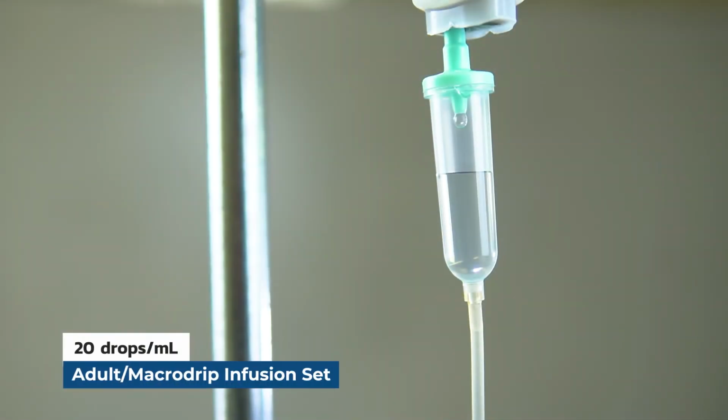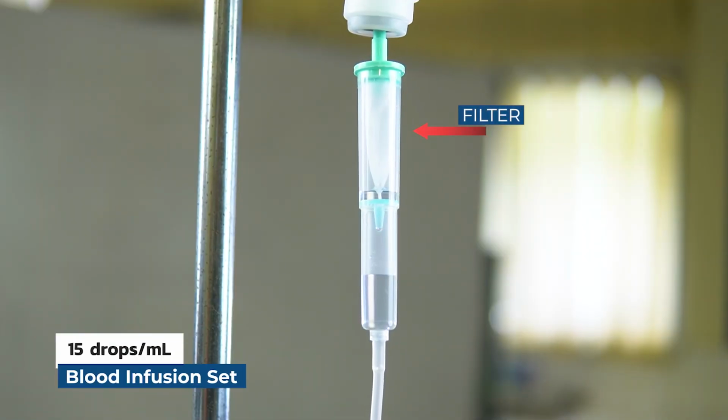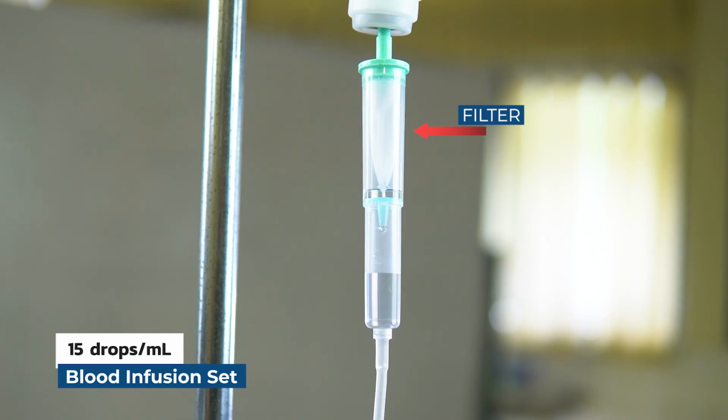Adult or macrodrip infusion set delivers large quantities of IV solution. It delivers at faster rates than microdrip set as it passes a larger quantity of fluid with each drop. 1 ml of liquid is equal to 20 drops. Blood infusion set is a device used for blood transfusion. Blood components must be filtered during transfusion to remove clots and small clumps that form during collection and storage. 1 ml of liquid is equal to 15 to 20 drops.